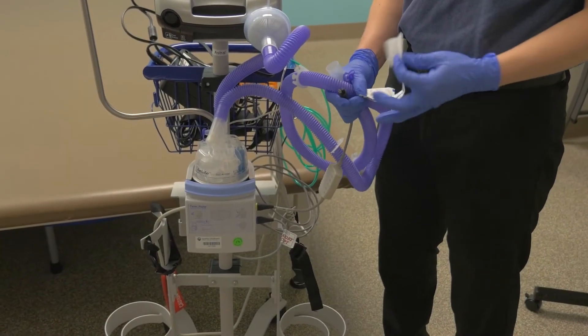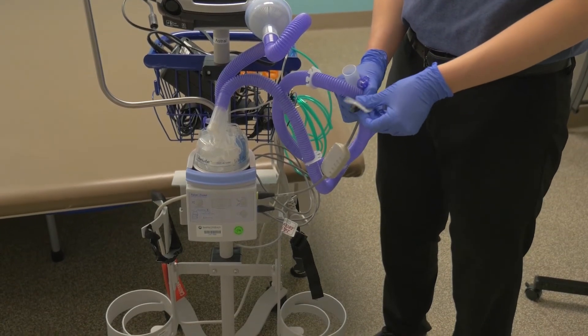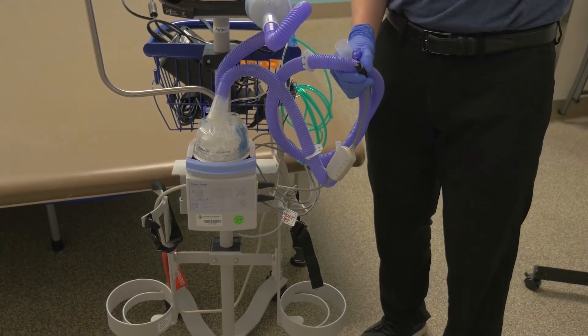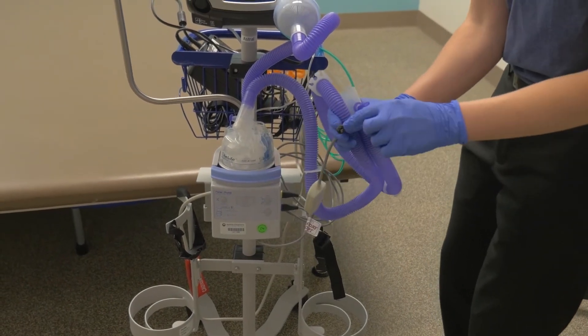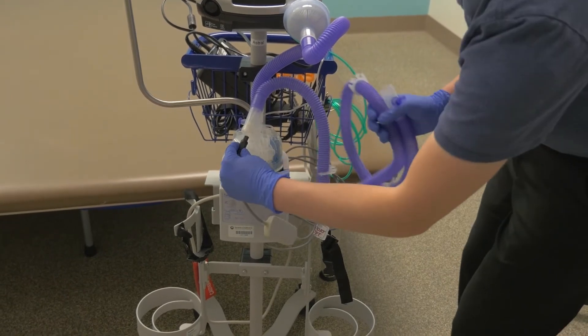The next step is powering the wires that are inside the circuit. Locate the black power plug hanging off the humidifier chamber and plug it into the area with pins facing right side up. The plug should be able to slide into place without resistance. Make sure it is facing right side up so the pins don't bend.